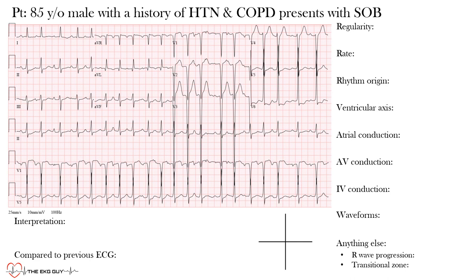First, what is the regularity of the rhythm? On first impression, the rhythm appears irregular — and that is correct. This is an irregularly irregular rhythm. We use the R-to-R interval, measuring from one R wave to the next. You can already see that these intervals are different, with no pattern to the variation, so we call it irregularly irregular.